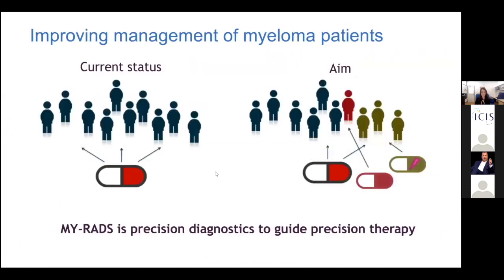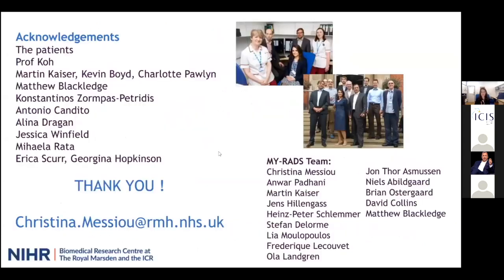So I hope I've managed to convince you that MY-RADS is offering precision diagnostics and really bringing precision medicine to life for patients with myeloma. And I'll just end by acknowledging really an ever-growing community of people that are working very hard to try and bring MY-RADS and whole body MRI into greater practice for patients with myeloma. So thank you very much for your time.